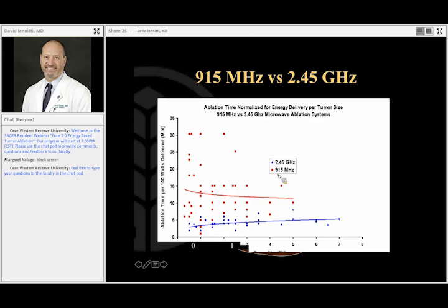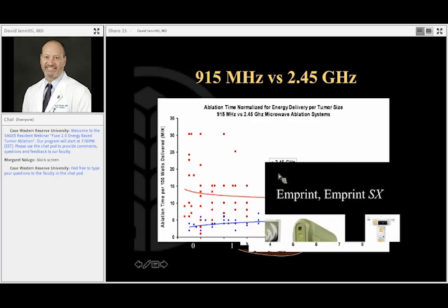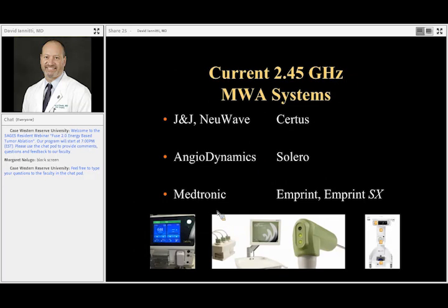So again, 915 has sort of gone away, and currently the three main systems in the U.S. are all 2.45 gigahertz systems, and we're on our third or fourth generation of microwaves right now. They're all slightly different, but they're all solid-state technology. They have little differences between them, but these are the commercially available systems today.